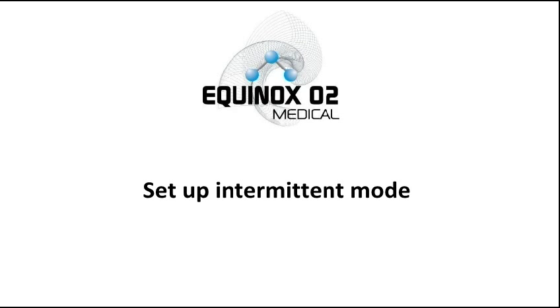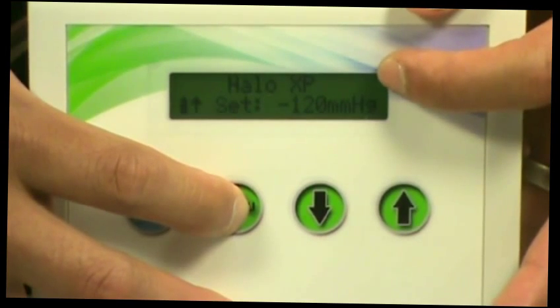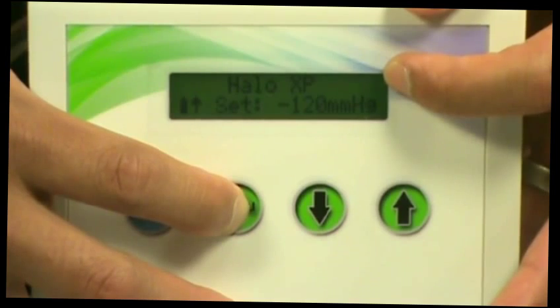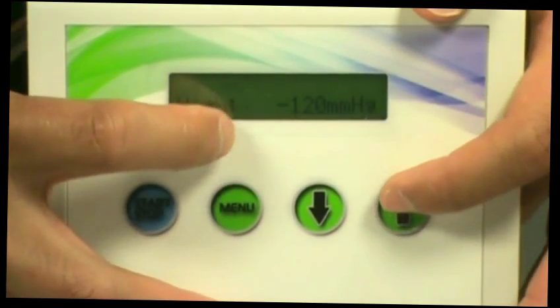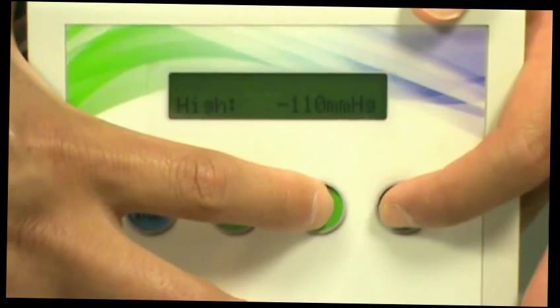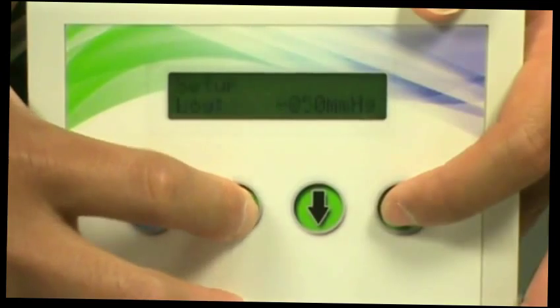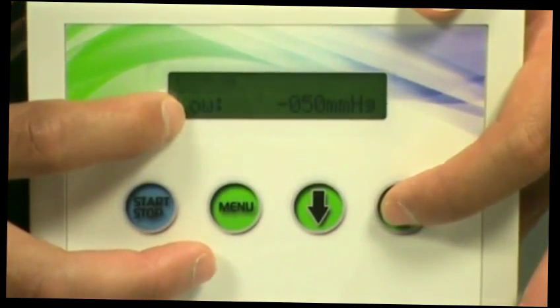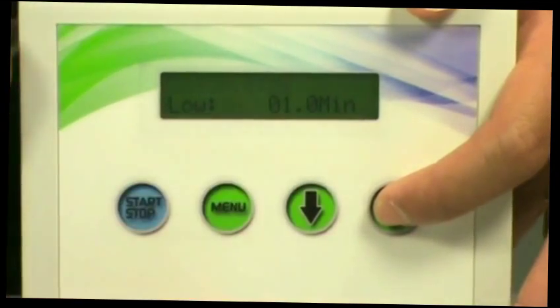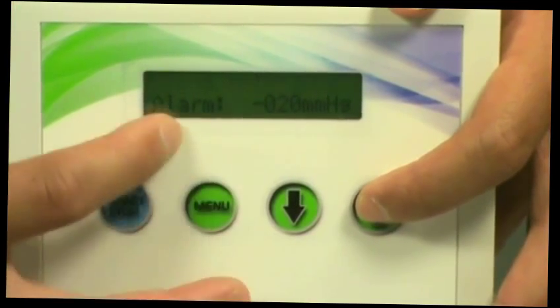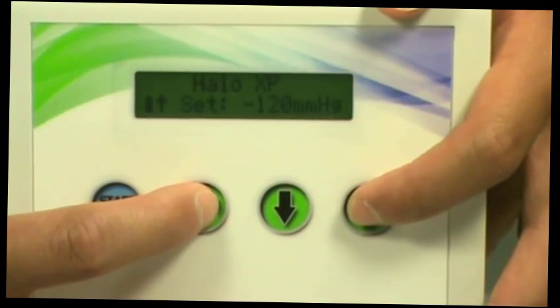Set up intermittent mode. Press and hold the menu button for five seconds or until you've reached the first menu option. And here you'll be able to set up your high pressure setting. Press menu for the time, set up for one minute. Low pressure setting, set up for negative 50. And set up for time as well, and that's for one minute. Set up your pressure tolerance alarm. Alarm on, delay alarm off.